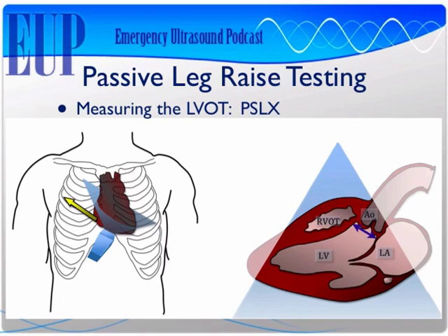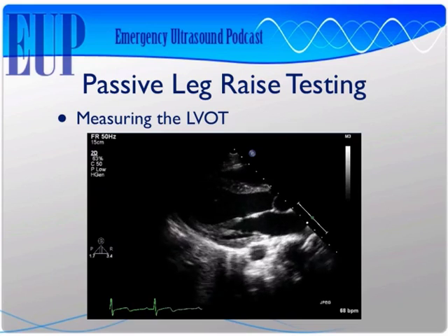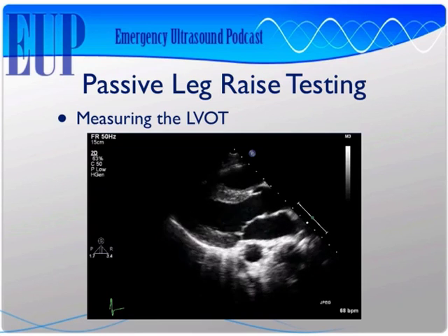Then I'm going to measure just under the aortic valve leaflets at the aortic annulus, which is right there. That diameter is my left ventricular outflow tract diameter, which is what I'm going to use to find the radius for my equation. So here's an example of a parasternal long axis window. You can see this is a normal functioning heart. You can see the aortic valve opening there in systole. It's that mid-systolic ejection period where I'm going to measure the LVOT diameter.